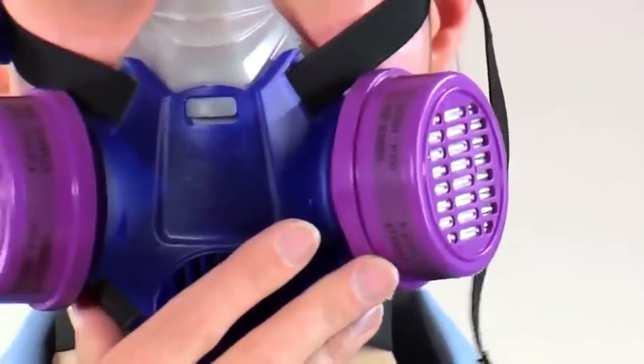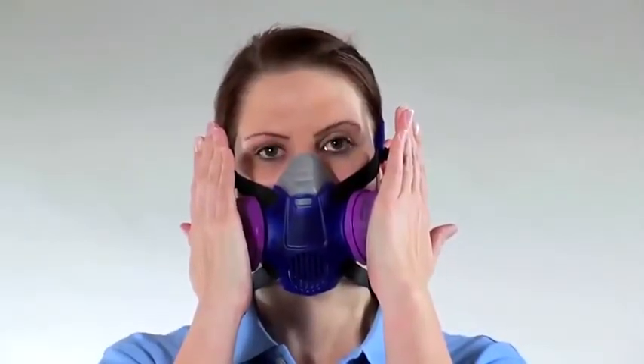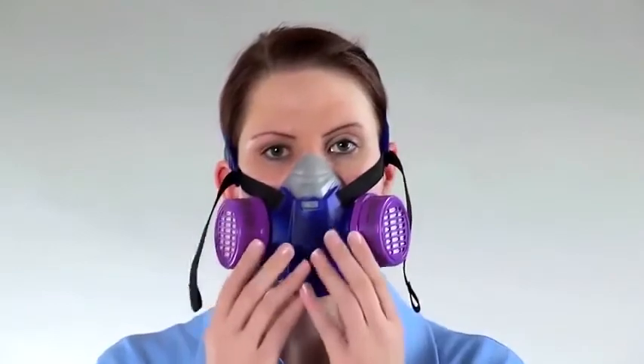If not, reposition the face piece and adjust the straps. Repeat the test until a successful fit check is achieved.